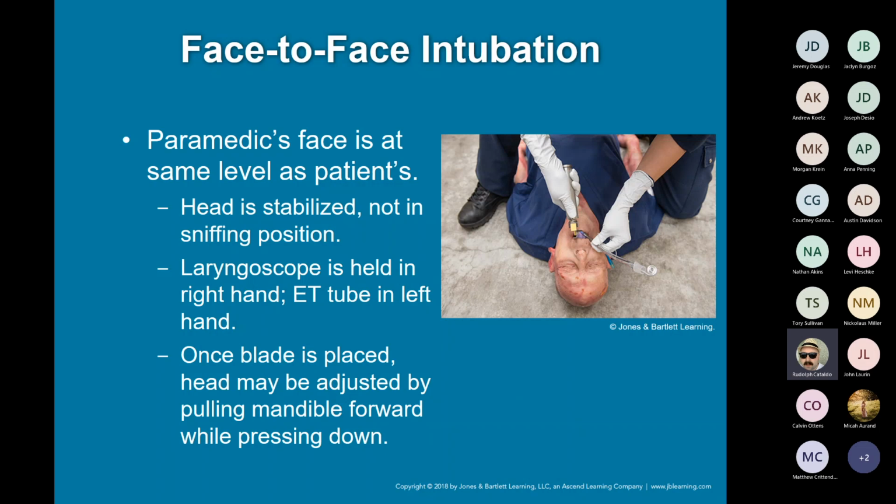And just this simple training, you can do it at your own fire department, your own EMS service, wherever you work. If you have an airway head, stick it straight up and down like it's sitting in the chair, and use a laryngoscope and see how easy it is to intubate it just facing it. It's pretty difficult. That's why it's not something we really teach as far as skills, because it's out of the norm, not something we do very often. But when it needs done, it needs done. What you'll notice about these kinds of off-the-wall skills is that you have to maintain your own proficiency in them. Otherwise, it's not doing you any good.